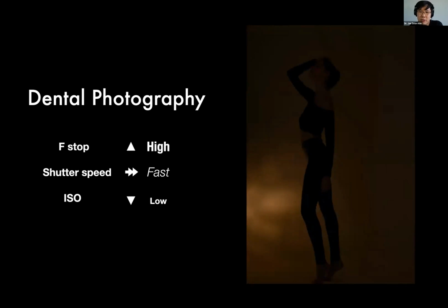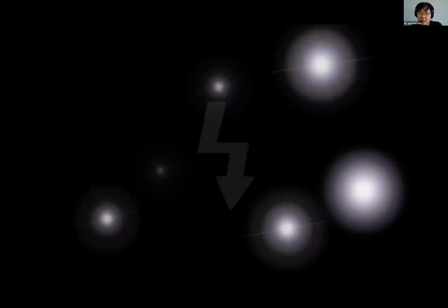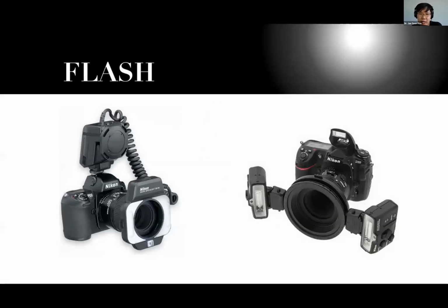is going to be a very dark image because you're actually reducing all the light that is coming into the camera. Dental photography is almost like taking pictures in a cave. We're taking pictures surrounded by lips and cheeks, and it's a dark place. So you need to have a fourth component, which is the flash. And you have different types of flashes that you can use. We have the ring flash, as you can see on the left, very good to use for posterior restorations or in the posterior segment of the mouth.